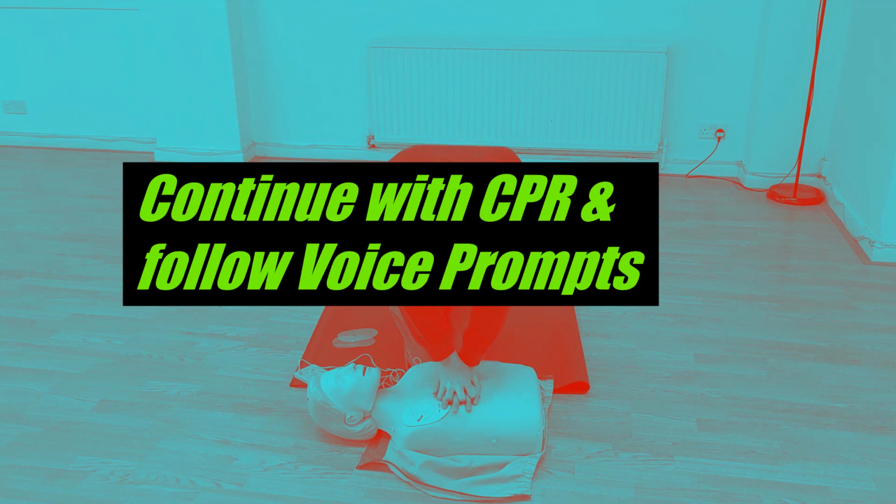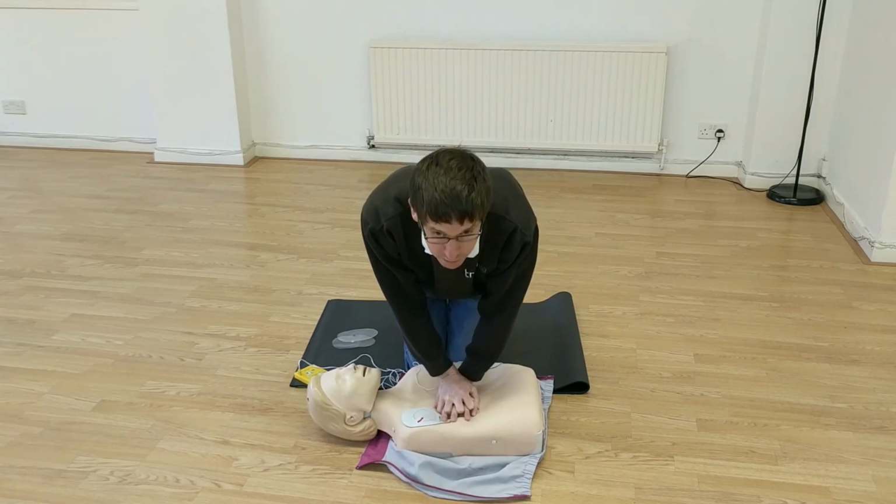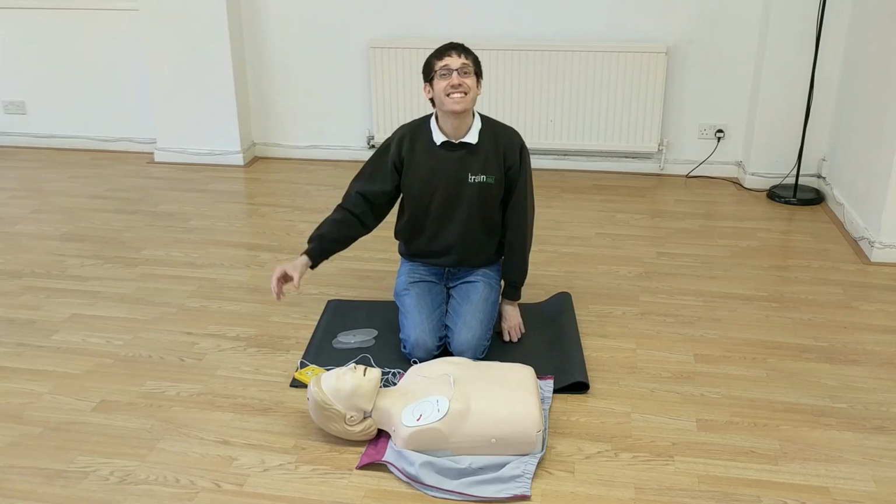Follow the instructions to start CPR. I'm going to continue to follow the voice prompts of the machine until it tells us to stop.